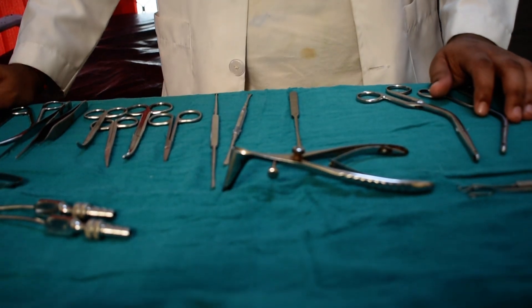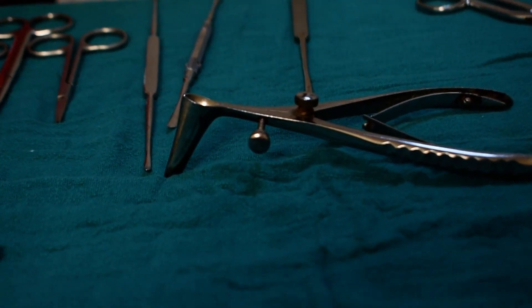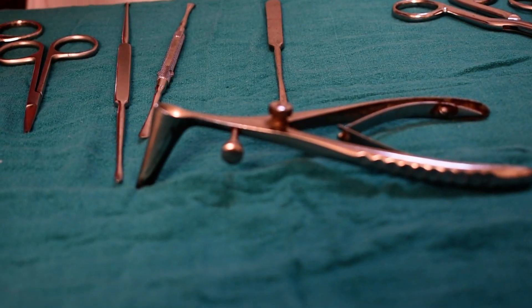Hello, this is Dr. Krishan. In our nose instrument series of the ENT residency made easy, we'll start with septoplasty instruments. We have already discussed the first instrument in the last video, so this is Kilian's nasal speculum of different sizes.